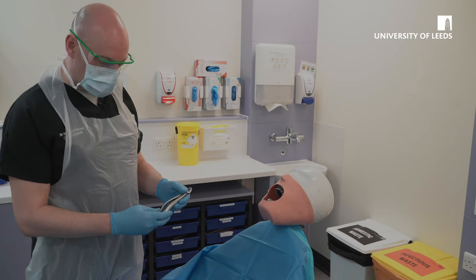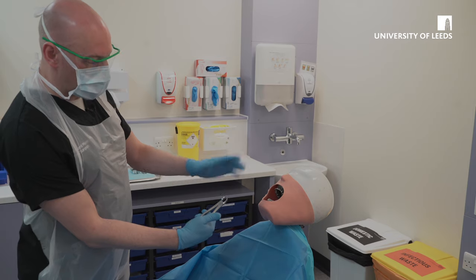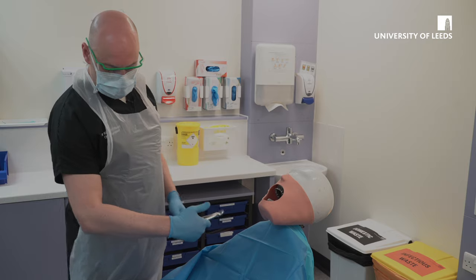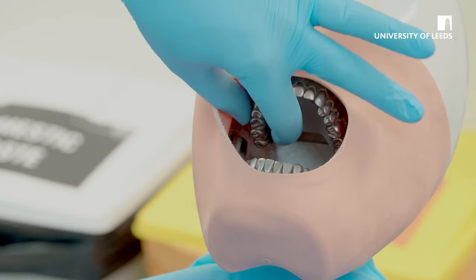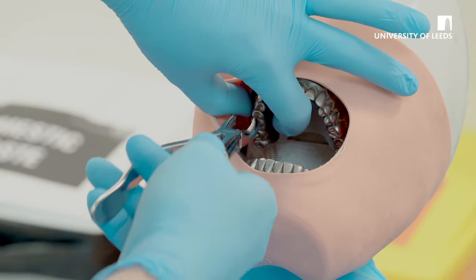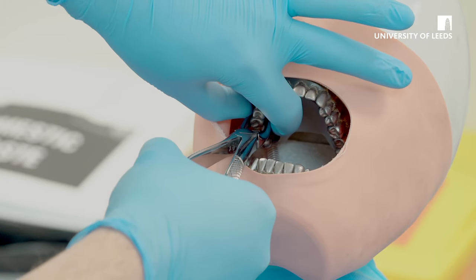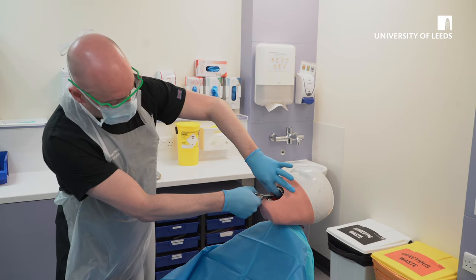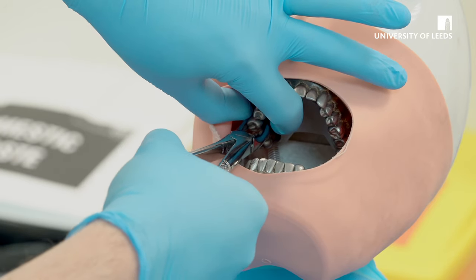To extract the upper right molars, as a right-handed operator, the beak goes towards the cheek — so it's buccal — and the curvature of the forceps is towards the fingers. The patient should be at about elbow height in the chair and 45 degrees. With the non-dominant hand, ensure that you support the alveolus, and then ensure you have the correct tooth before placing the forceps in an apical direction. Pushing apically, ensuring that you support the alveolus, and gently push buccal, and slowly bring the forceps back to the midline.